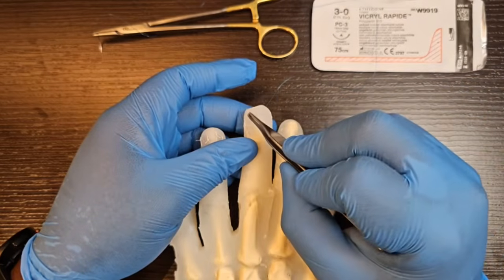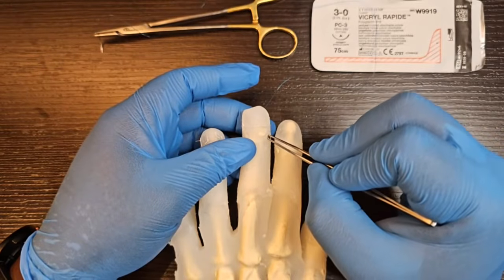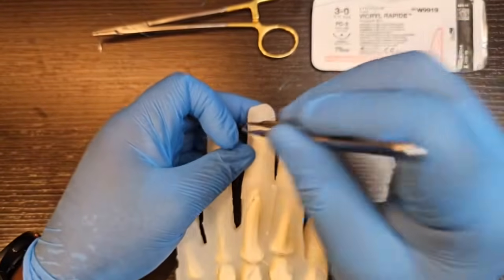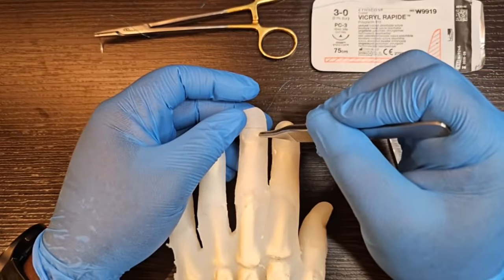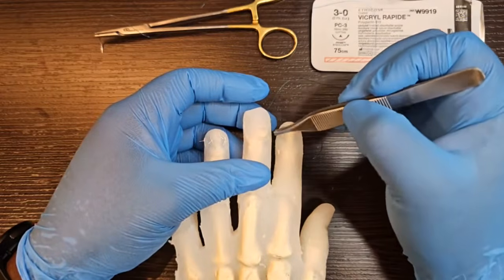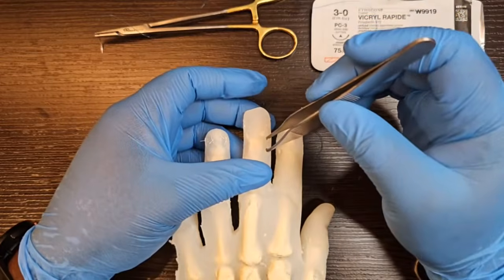Oftentimes cuts can go in this direction, cut with a knife when taking out an avocado seed or digging out burgers, and the knife slips suddenly through the burger and you can cut obliquely. If a cut goes across the skin like this, you need to be suspicious that the cut goes into the germinal matrix. So you need to assess the germinal matrix actively. To do that, you can put a forceps or a skin hook underneath, reflect it back and look.